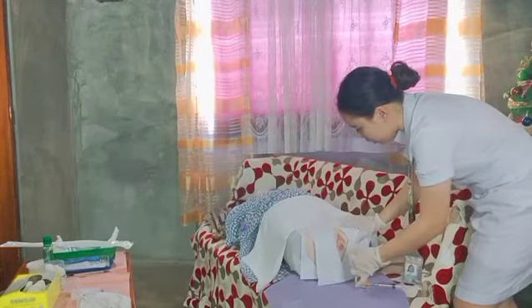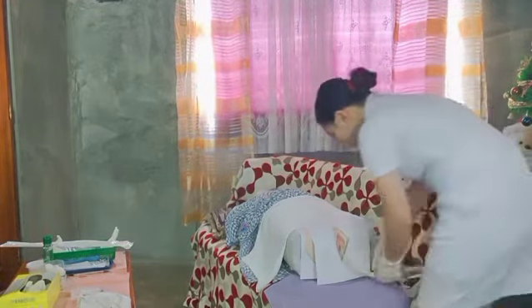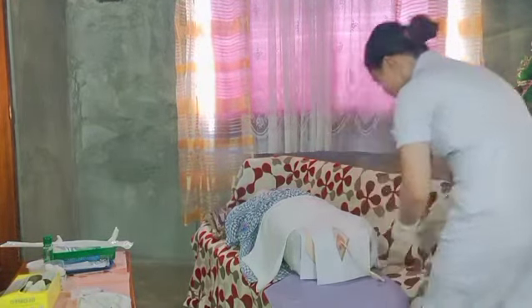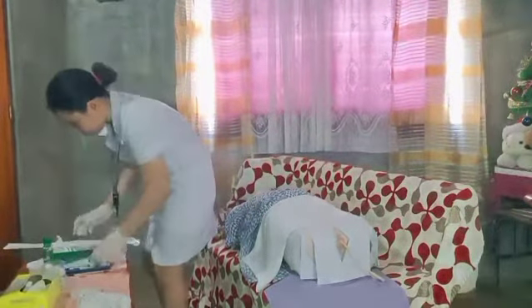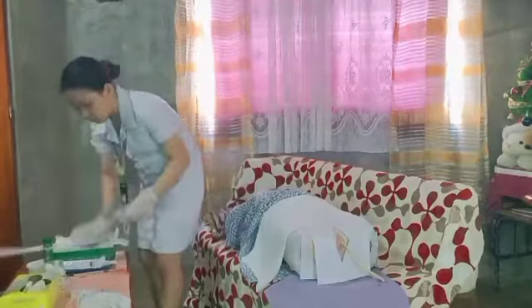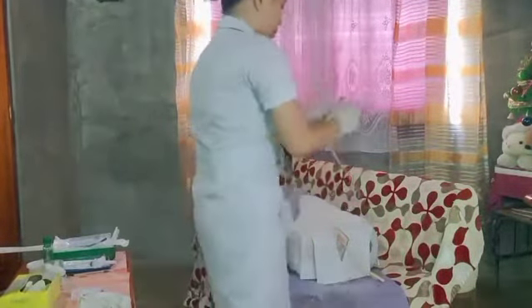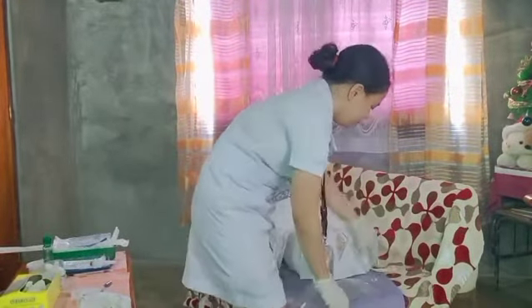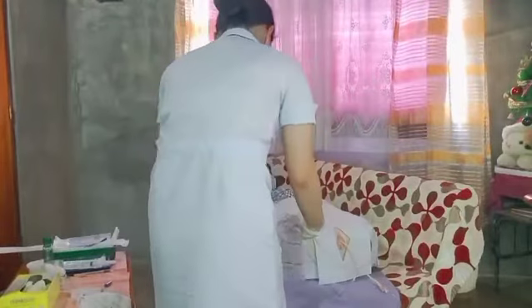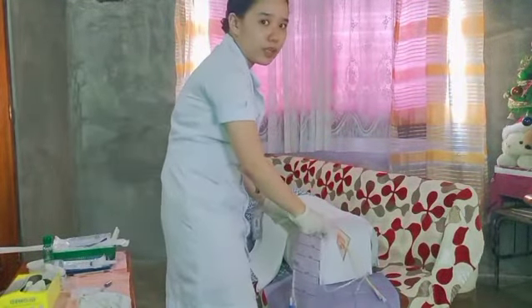Okay naman siya. So we are going to secure it under the patient.